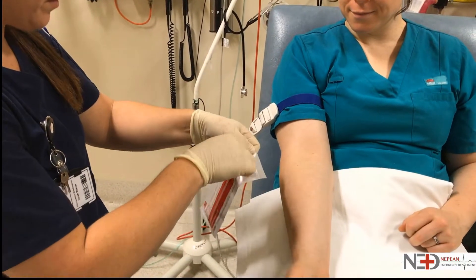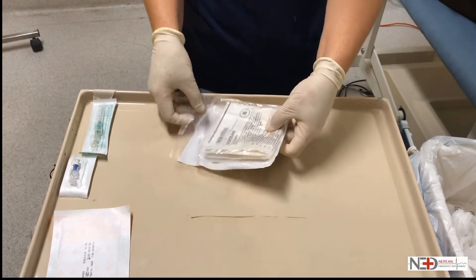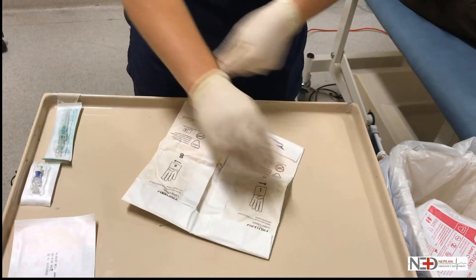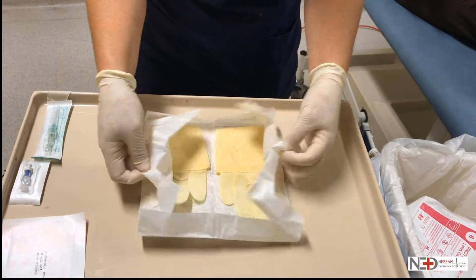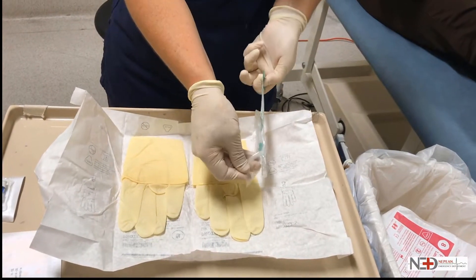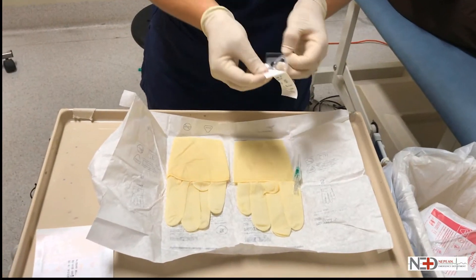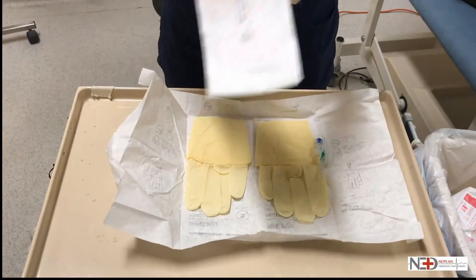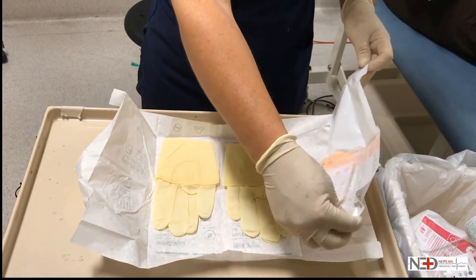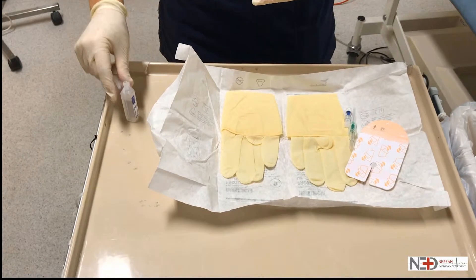Disinfect the skin properly — what is recommended will vary a little bit from institution to institution. Set up your equipment. Here we see the opened glove area being used, but you could of course use a dressing pack. Note how everything is carefully opened onto the small sterile field, including the IV cannula — in this case an 18 gauge — the IV bung, and the IV Opsite 3000. A small rubbish bin should be kept nearby so that rubbish can be removed from the area efficiently, and the sterile water can be opened and placed carefully outside the sterile field.